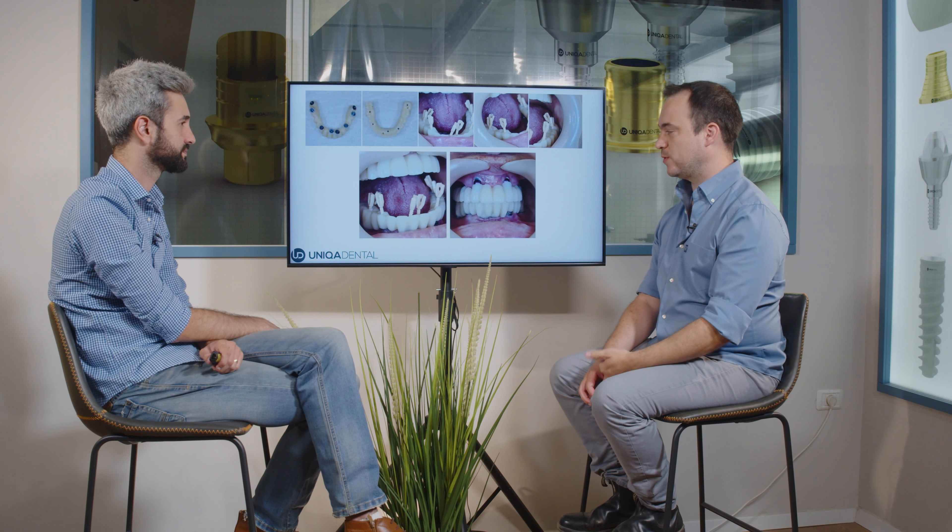This is the form of the teeth that we have before we start to make zirconia crowns. And now you send him home for like three months? Yeah, we send him home to get used to it, to tell us what he likes and what he doesn't like. Before making the final crowns, you need to wait some time and see that everything looks fine. All in all, it's much better than the prosthesis he had before.